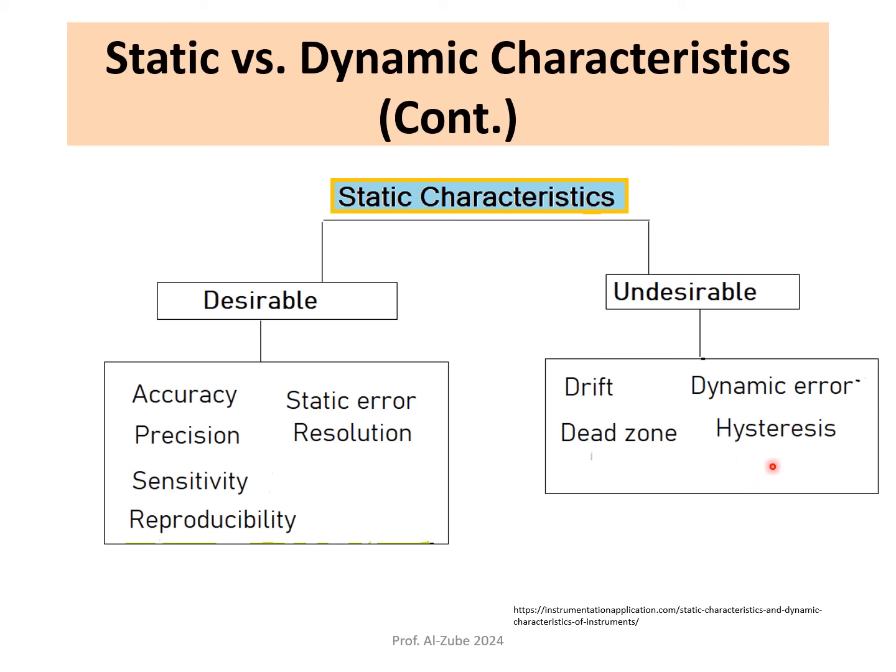So if you're reading positive values and then suddenly you're reading negative values, there is going to be a hysteresis, which is a lag in the response of the instrument because of this sudden change in direction of the measurement. That's something that we measure.